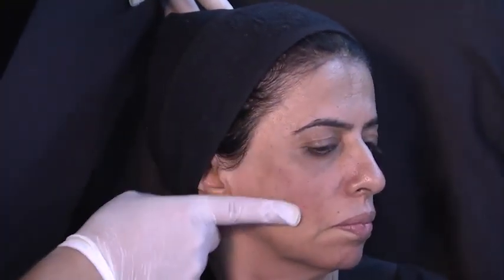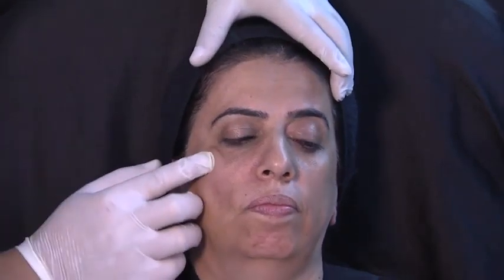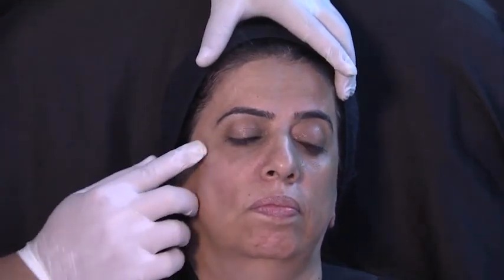We're done with that. Little bit of cream. Okay, look, even here we can still see a little bit of the structure of the product, okay? So let's, wait, we're gonna do tear trough. Look at the camera, go like this, okay? And here, we have restored that volume at the same time giving some support to the bone.